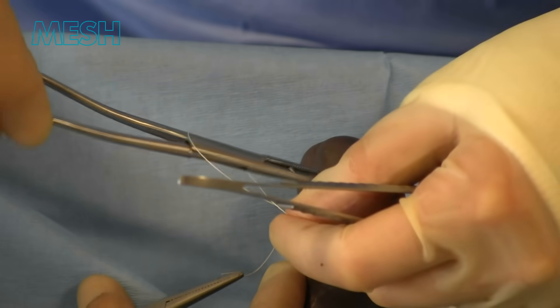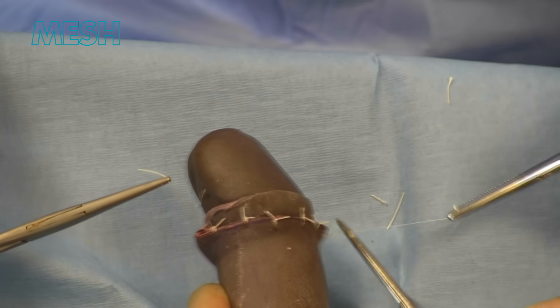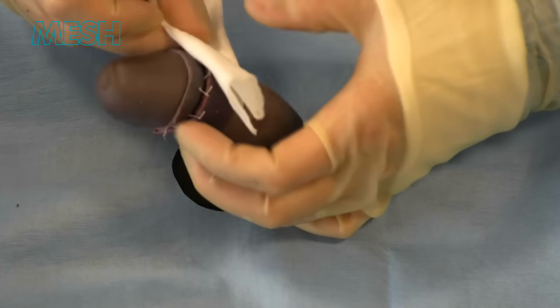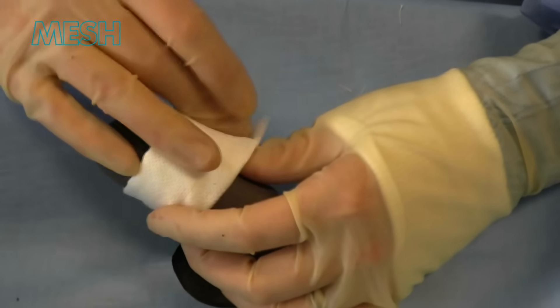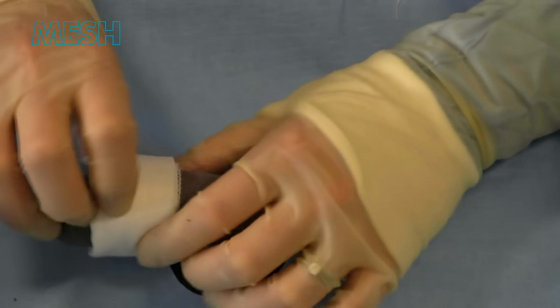On completion it is possible to use some chloramphenicol ointment and gauze dressing. Both sutures are cut at this point. It is a good idea to place some gelanet to prevent the gauze from sticking, and this can be held in place with a small piece of tape.